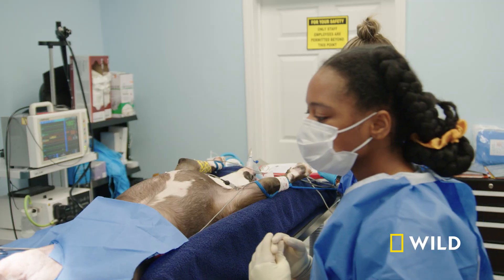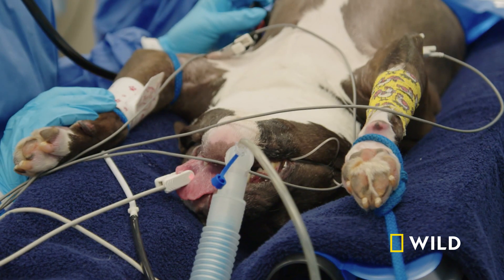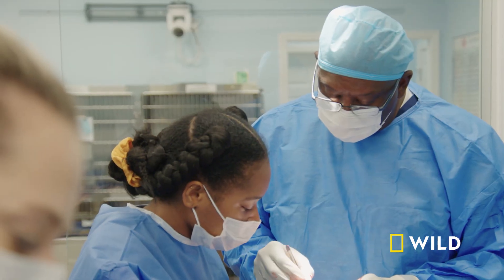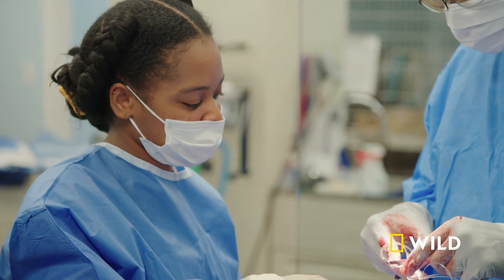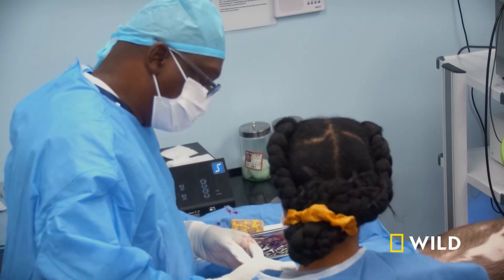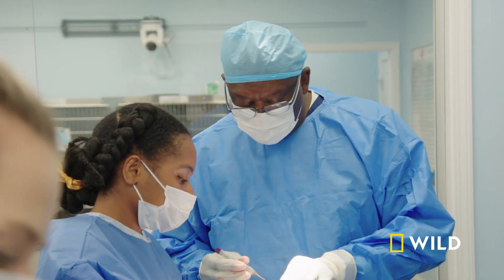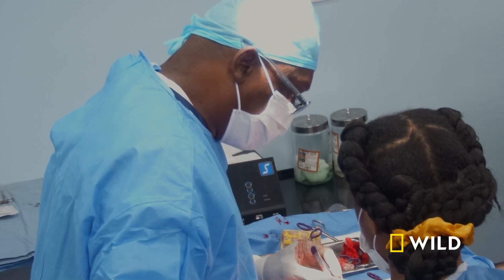You ready for me to cut? Going in the joint. It's hard to see in there because it's a very small little area. See these little things that are frayed up right here? That's the torn ligament. So we're gonna take those little pieces out of there. As I open this joint capsule, I can immediately see this ACL — it's all frayed. So basically what I have to do is remove those damaged parts because it's gonna cause a lot of pain and inflammation in the joint if we don't remove it.